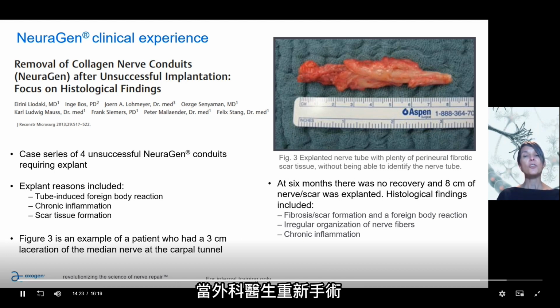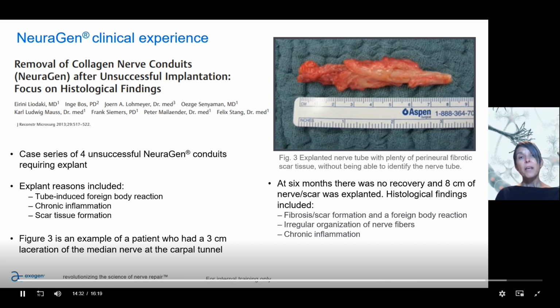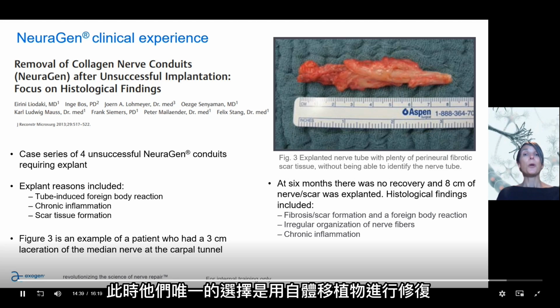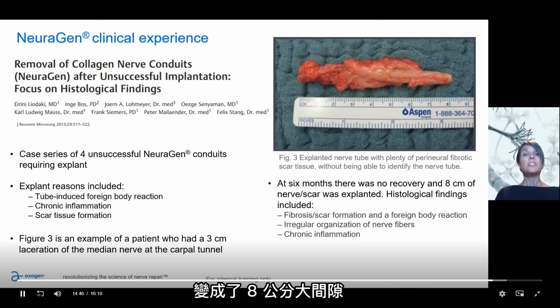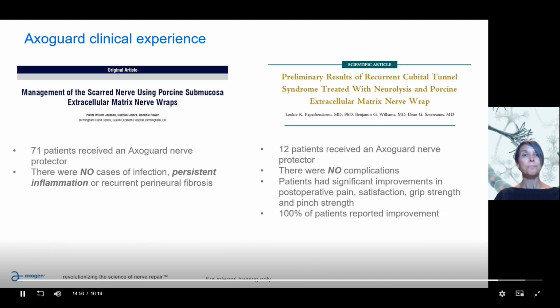And when the surgeons went back in, there was so much scar tissue that they ended up having to resect 8 centimeters of nerve and scar. Their only option at this point was to repair with an autograft. And so they went from having a 3-centimeter gap originally to having this big 8-centimeter gap as a result of this inflammatory response induced by this collagen conduit.